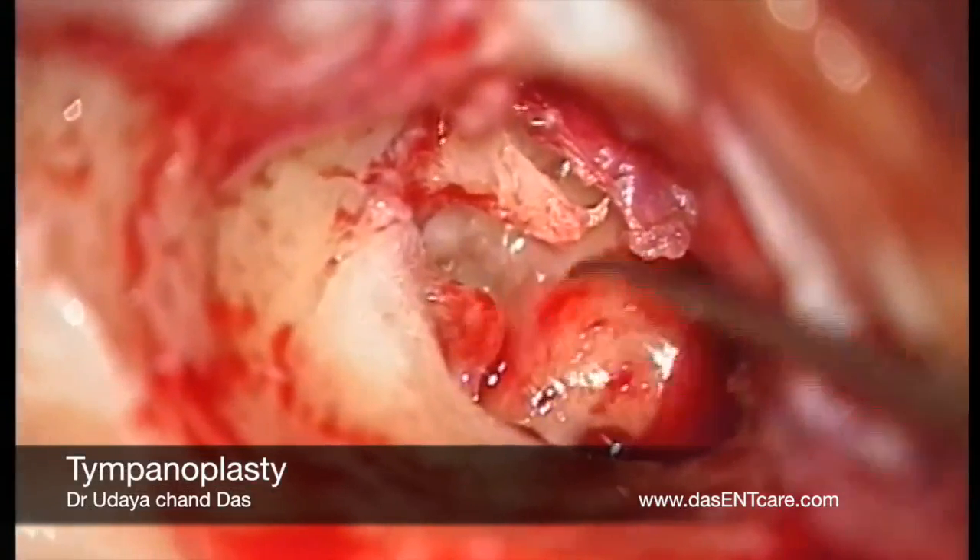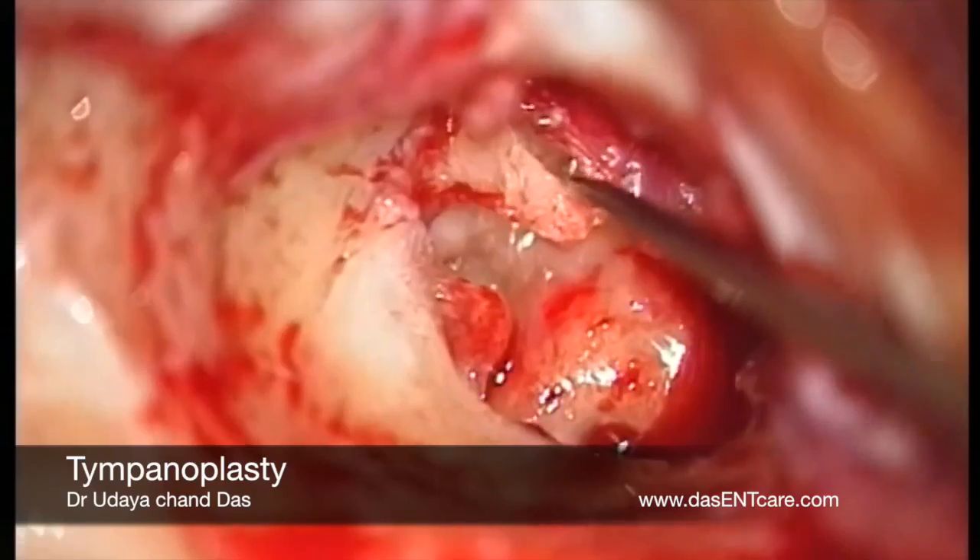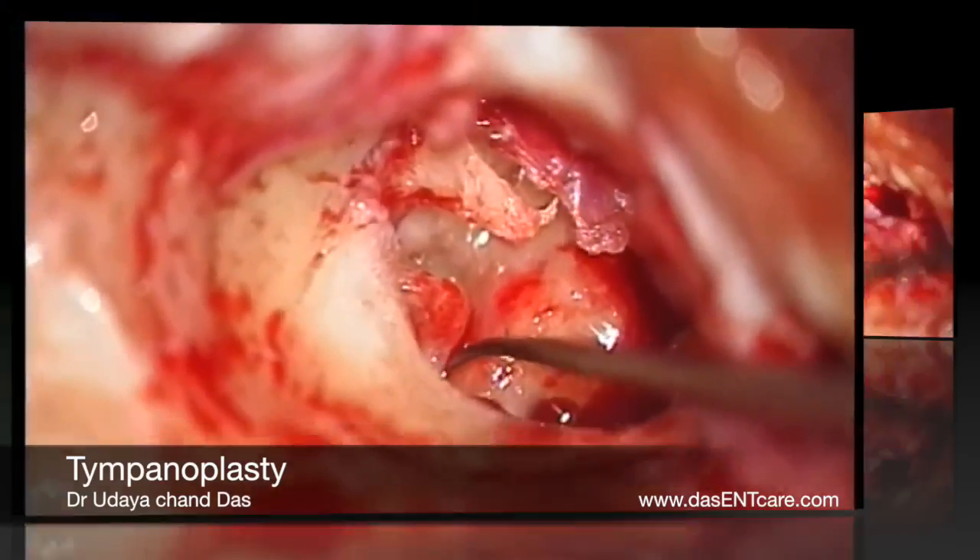Saline wash is given and we confirm the saline flow from the mastoid antrum into the middle ear. Once again the ossicular chain mobility is checked. It is mobile, and that is the stapedius tendon.